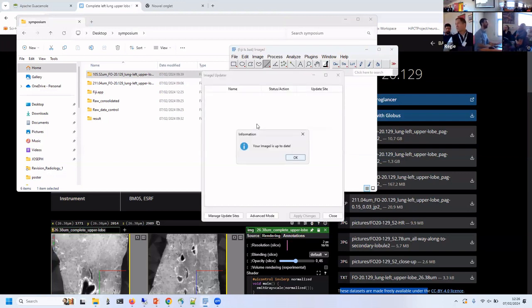Yeah. Neuroglancer uses a Zarr file format. It's N5 for us, but we're trying to move to Zarr. It will be the goal. Then the data viewer could in principle be Zarr. It could also, yeah. We didn't try because the data size will be massive. The problem is that Zarr is single hierarchy in the current implementation, so we need a multi-hierarchy.